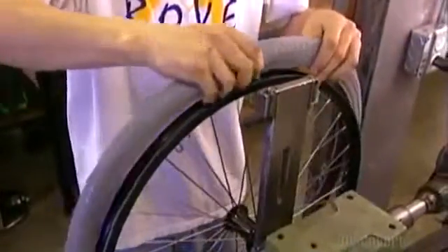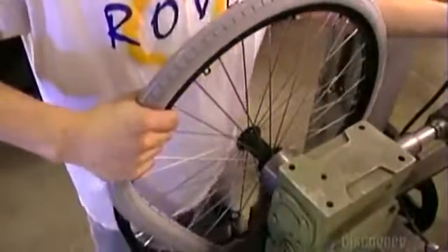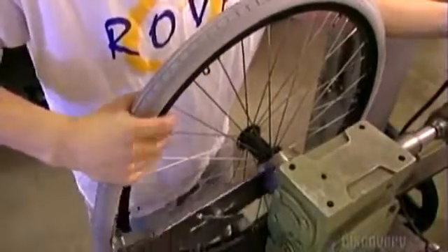Tires are either pneumatic, with an inner tube of air, or rigid — just one solid piece of rubber. A machine stretches the tire to fit the wheel rim.